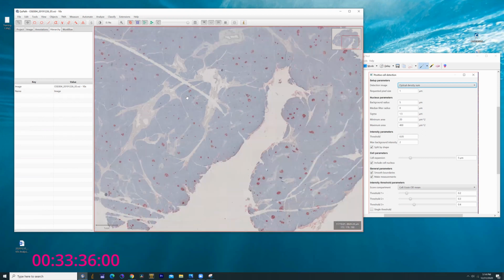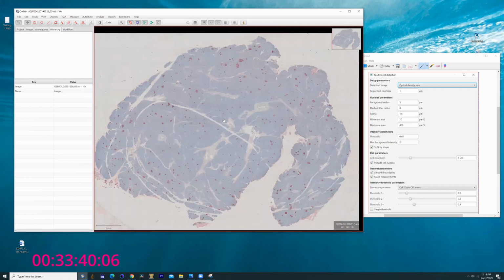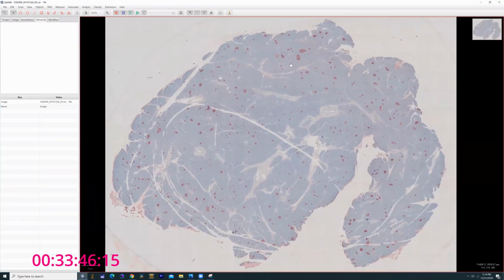And what we're about to do is scan an area of like millions. So essentially the little script is kind of unstable, and it's better if you limit your analysis to one set at a time and then move within. Don't try to load up too much work from data coming out of this hierarchy. I know it sounds weird, but just work with me on this.